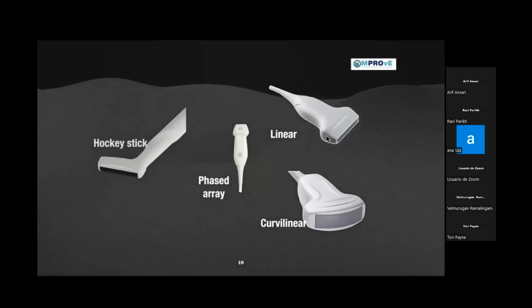There is no difference of R1 and R2 zones, so you see the entire lung, and it gives you quite a good view of the artifacts in one go. So less handling time with the babies, and quite understandably, those are fragile babies. You don't want to upset them for long.